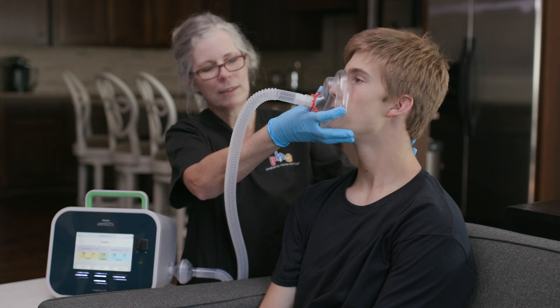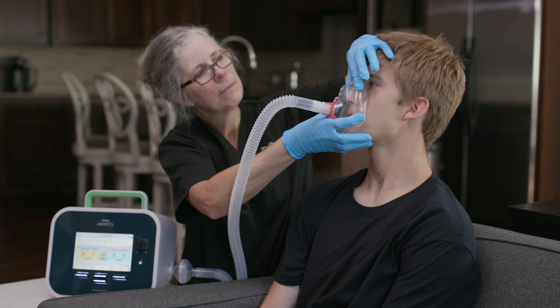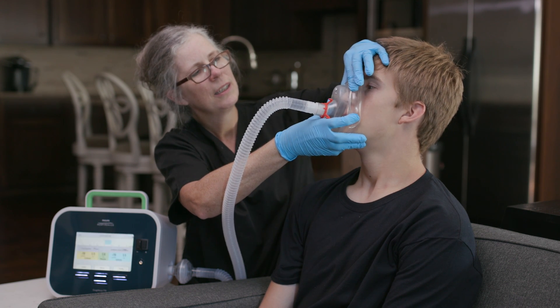Repeat the inhalation and exhalation cycles, followed by a rest period, as prescribed by the health care provider. Remember to allow the device to provide inhalation pressure one last time before starting the rest period.